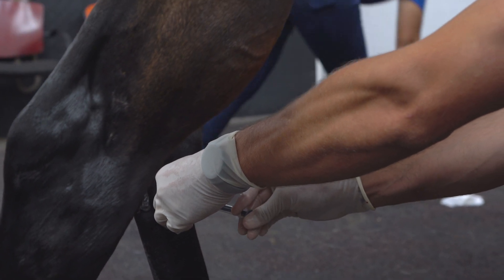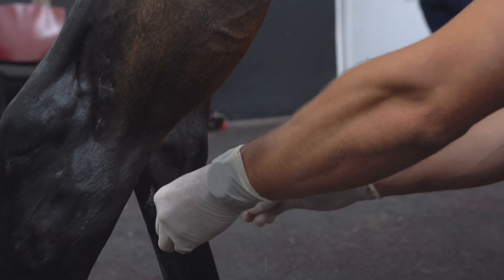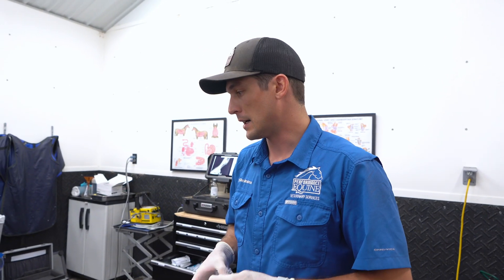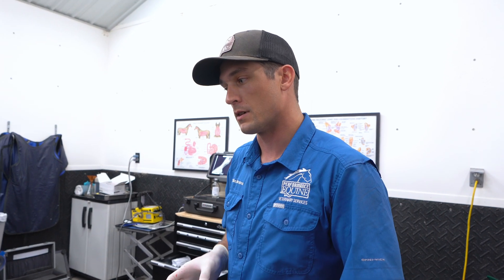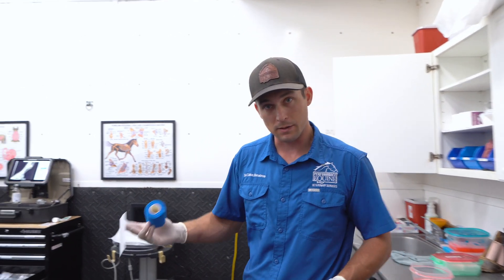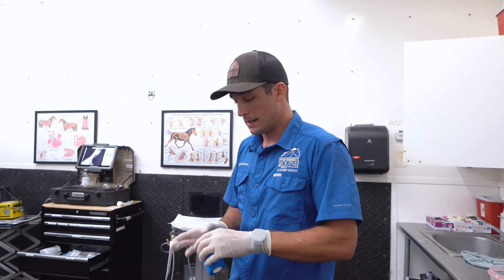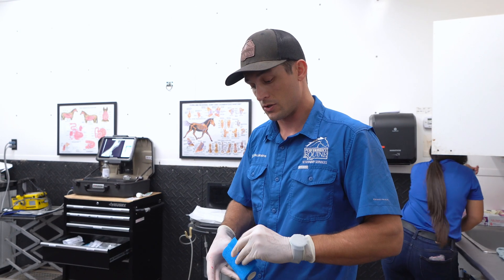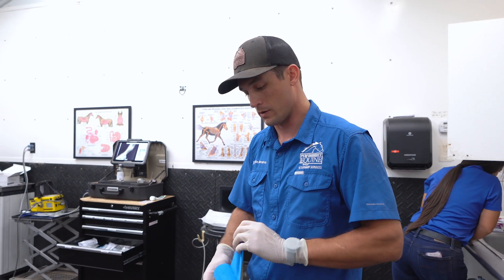This one's a little trickier to get into — there it goes. This one's a little tighter too; she might feel the pressure and pull that leg up. But that's right where she needs it. So this mare is pretty sore — we've treated multiple spots with the alpha-2 macroglobulin: the front coffin joint, the left hind coffin joint, and both hocks. We'll give her a few days of rest, a few days of systemic anti-inflammatories like Banamine, then slowly bring her back into work. She should feel a lot better than when she came in this morning.